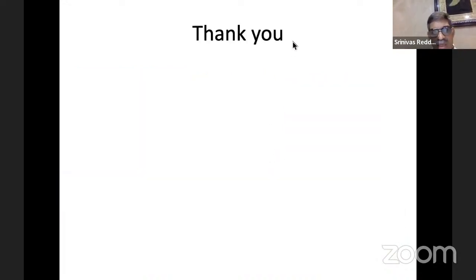What I want to say is, if we know the proper safe zones, and everyone knows how to pass wires, proper safe zone knowledge will make our life comfortable, and it takes less time. I can finish in 1.5 or 1 hour 45 minutes. The fixator time will be less than the time for the tibia, because in the tibia we need a lot of fixation points; it is load sharing.